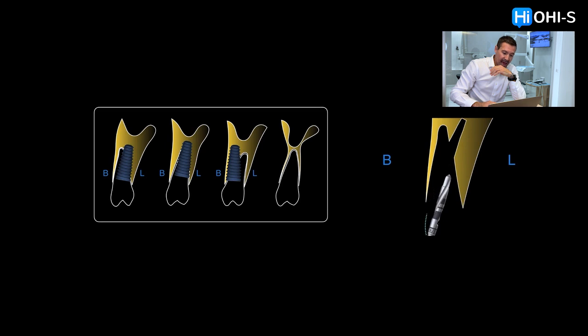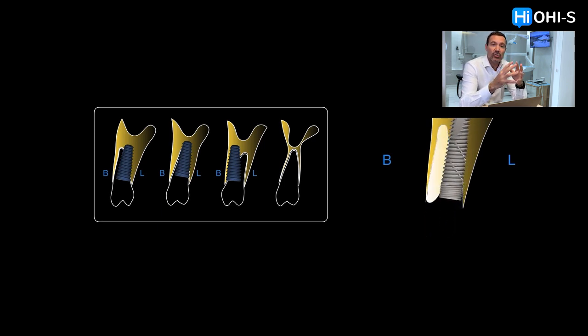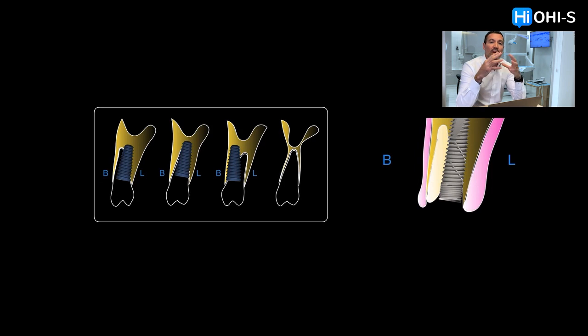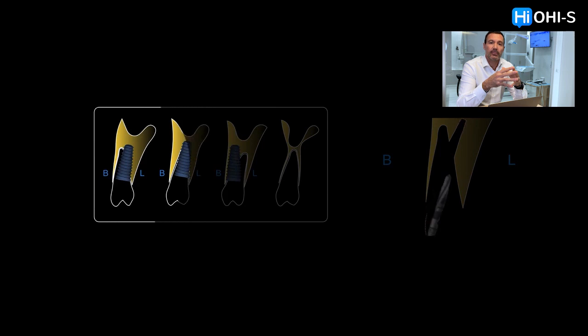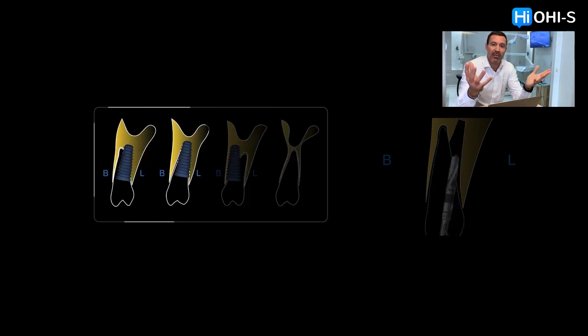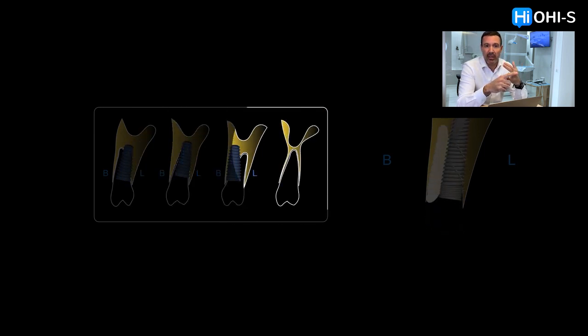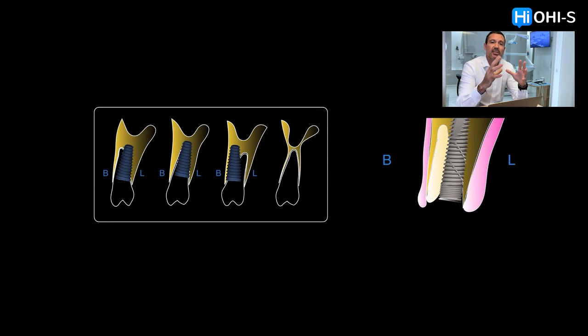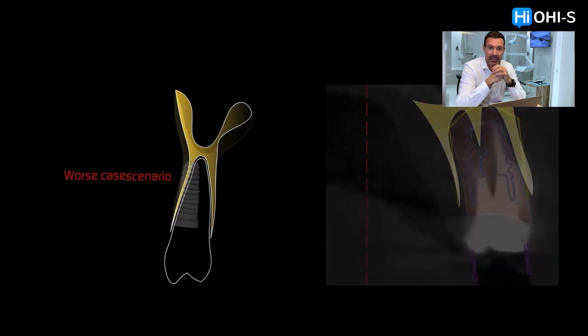The analysis of the anatomy to guarantee primary stability of your implants. If we are going to use an immediate loading technique for our patients, we are committed to providing this kind of treatment, and it's mandatory to achieve primary stability. That primary stability will depend on so many factors: the anatomy, bone resistance, the design of our implant. This is part of the process that we need to learn before performing that technique and before offering it to our patients.